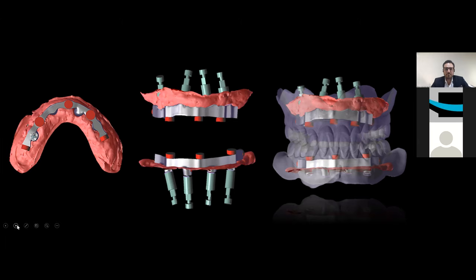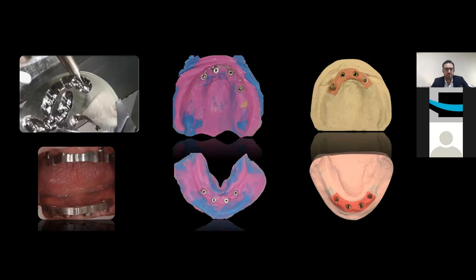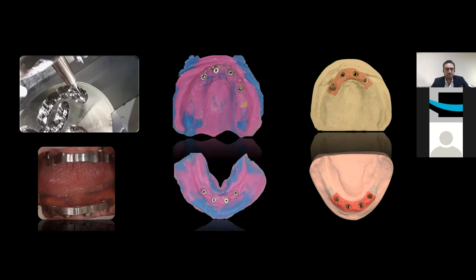But in another webinar, maybe we can talk about the digital impression on implants, if you want, Luca, if you want, Veronica, because I think we can't talk about it in a perfect way in so few minutes. If you want a perfect shape of the posterior tissue, when I have the final bar and I fit it inside the mouth, I want two final models.